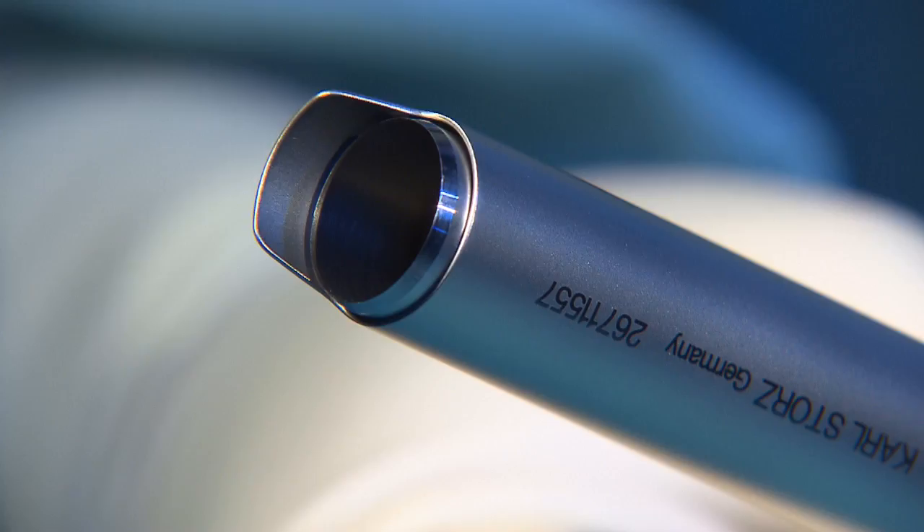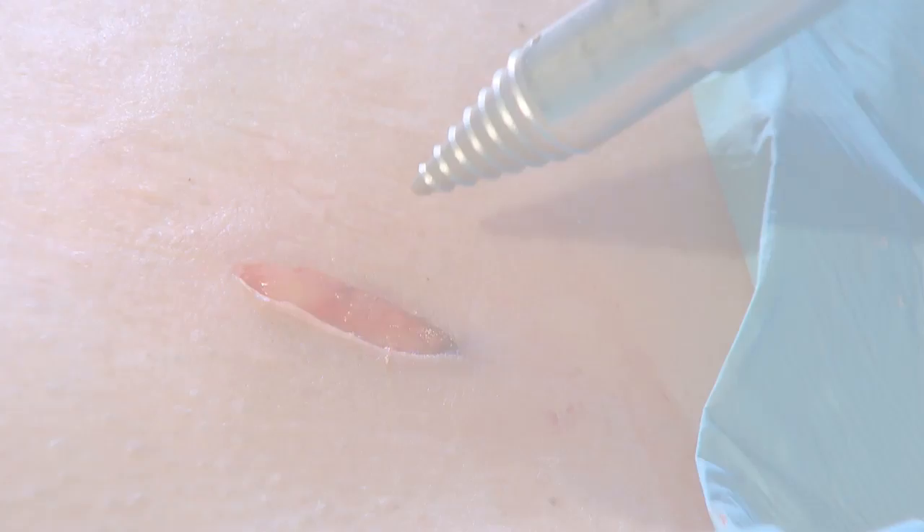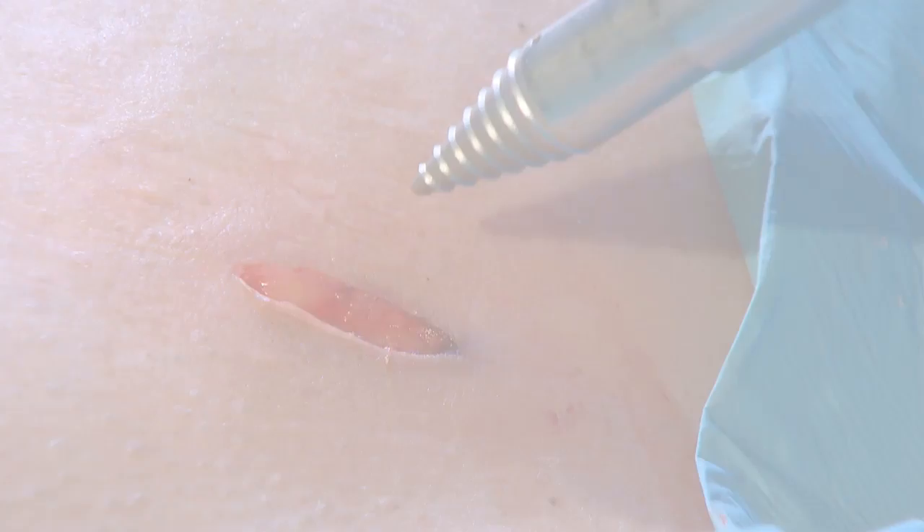The knife guard features a spring mechanism which allows the knife to retract into the guard. In this state, the morcellator can be used like a trocar, which rules out accidental vascular or bowel lesions.